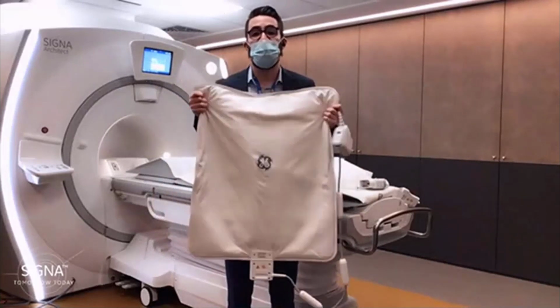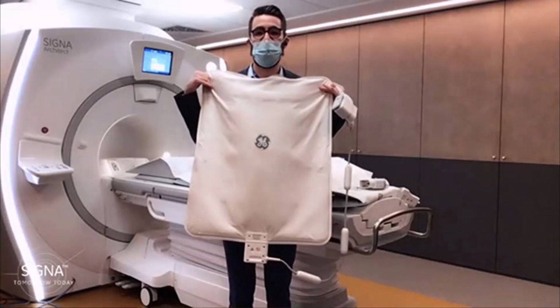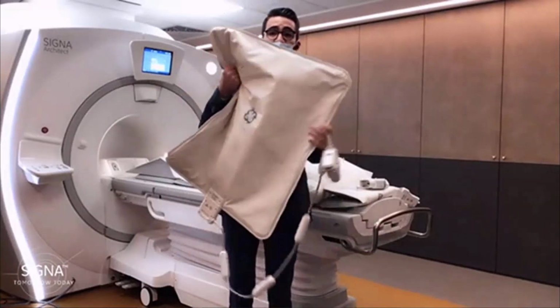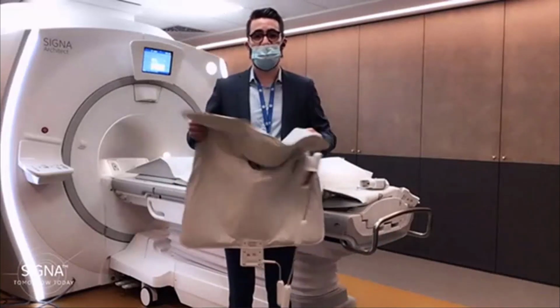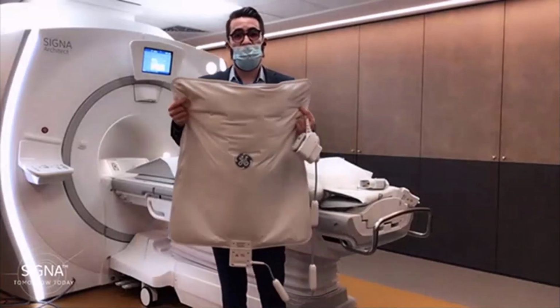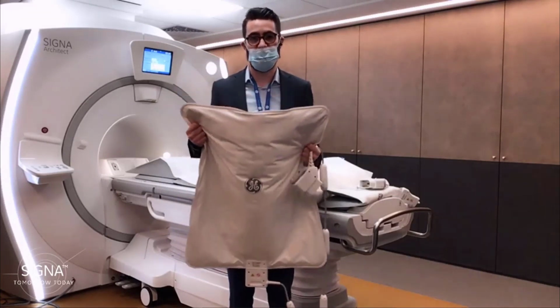So, when it comes to scanning the abdomen, patients will definitely prefer to be scanned with this kind of light coil. And the coil is also really flexible. You can see that I can really wrap this coil in all directions, and it really helps make the coil fit the patient's morphology.